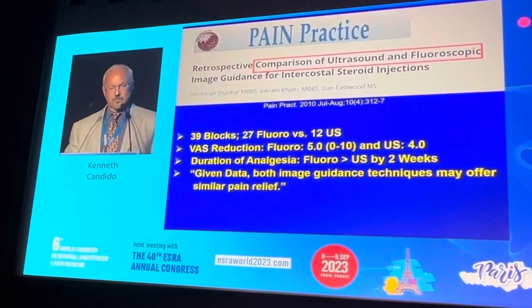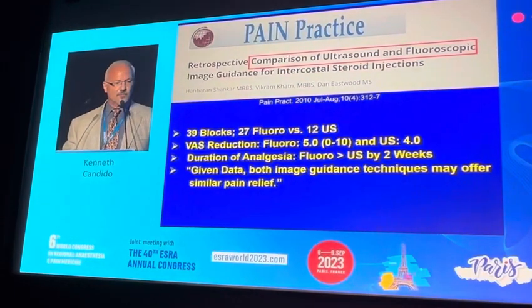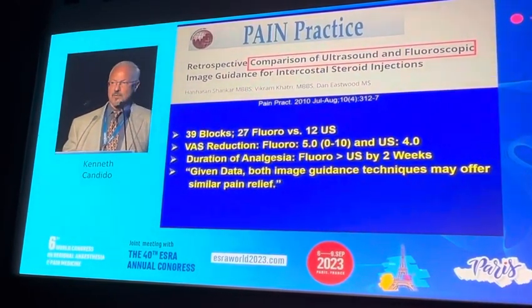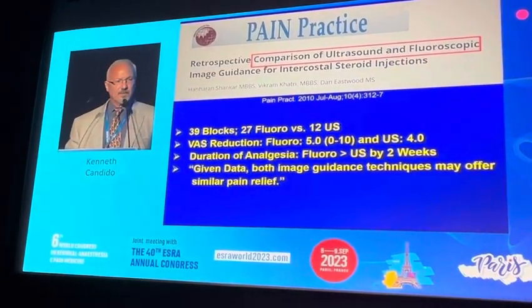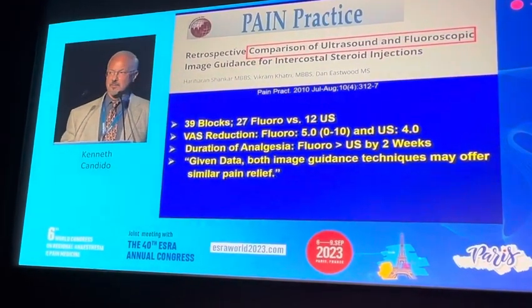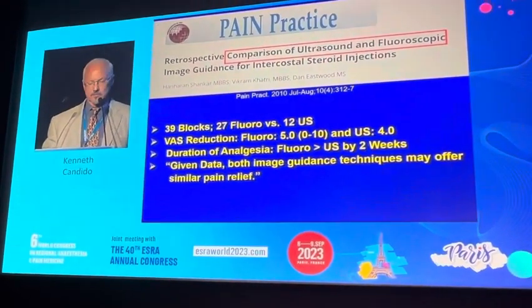And here's a nice study which goes all the way back to 2010 from my good friend and colleague, Dr. Shankar from Wisconsin, who looked at fluoroscopy versus ultrasound-guided intercostal blocks. In point of fact, fluoroscopy had a superiority in terms of pain reduction and the duration of pain reduction versus ultrasound. So I think it's a mixed bag whether we elect to use ultrasonography for our patients versus fluoroscopy.